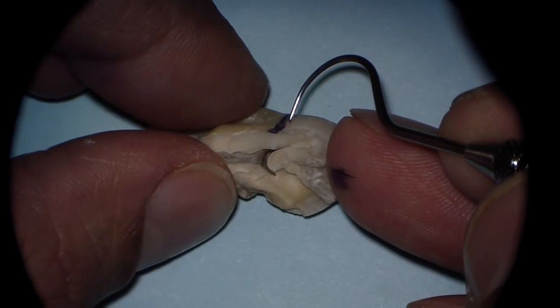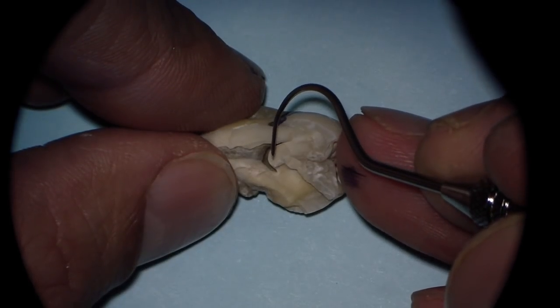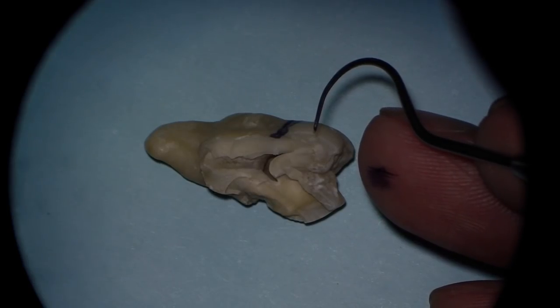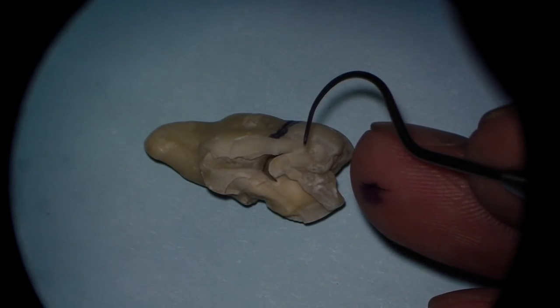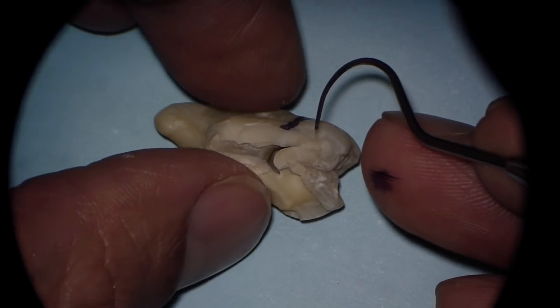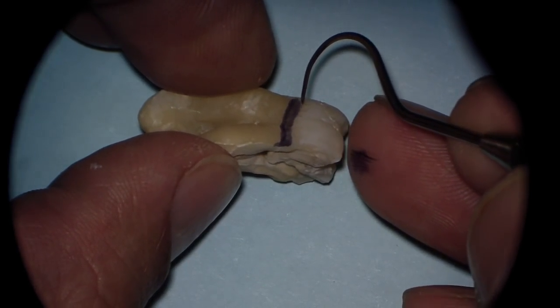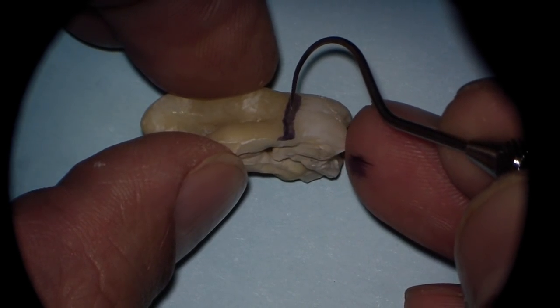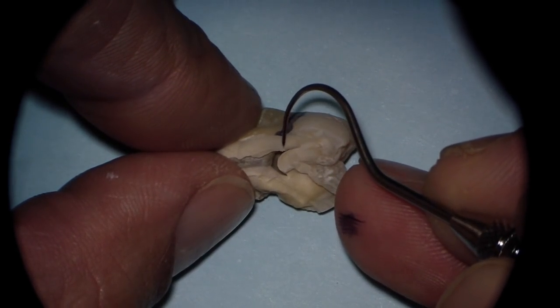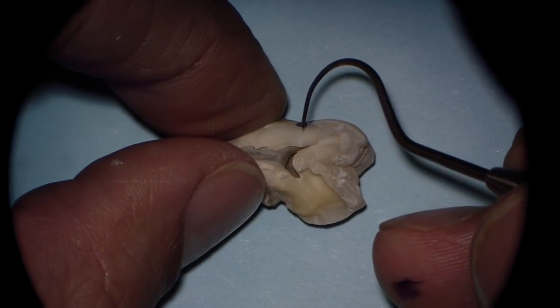One of the conclusions was that the CEJ was at the same level as the roof of the pulp chamber — in 97 to 98% of the time in both maxillary and mandibular molars. Here's the CEJ: I've taken a black marker and where that darkening line is, that's where the CEJ is, and if you run it across, sure enough it's at the pulp chamber. Now this is generalities — remember teeth do change through time with age.